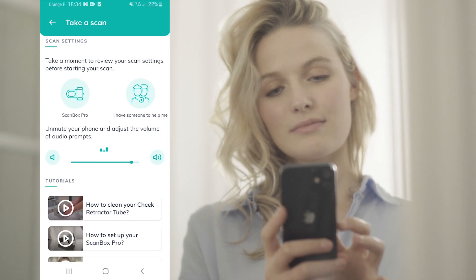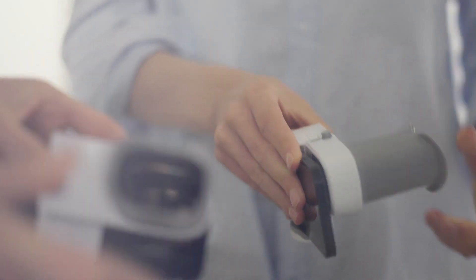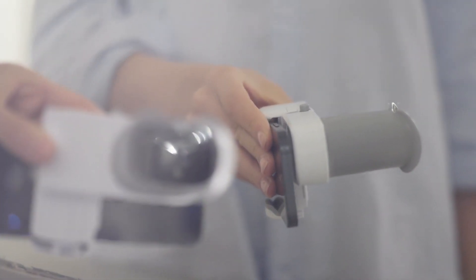Remove your aligners. Unmute your phone and follow the on-screen instructions. Place your phone into the phone support. Insert your cheek retractor tube into the phone support. You will hear a click when your phone support is properly attached to your retractor.